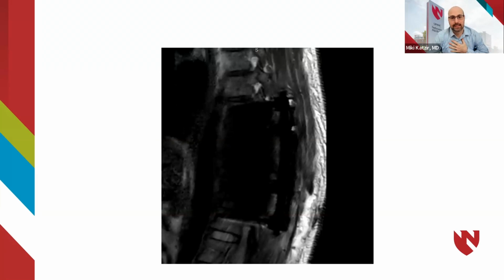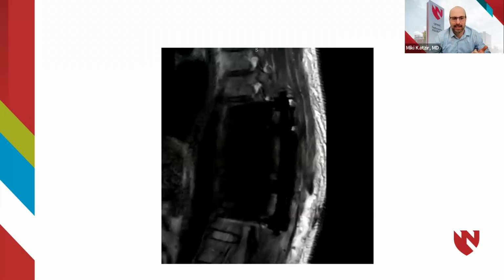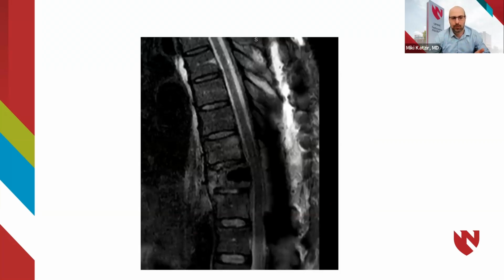I did it with a 3 Tesla MRI, and they recommend using a 1.5. So this is a 3 Tesla, very nice picture. Look at that, same scan, same patient, 1.5. I go back, 3 Tesla, 1.5. Beautiful, like completely different. But then unfortunately, my first infection happened, and the guy got infected.